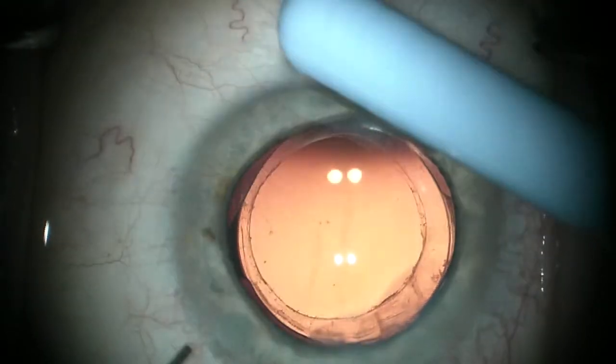Sometimes when the lens has been in there for many months — or two years, which is the longest I've been able to get one out of the bag.